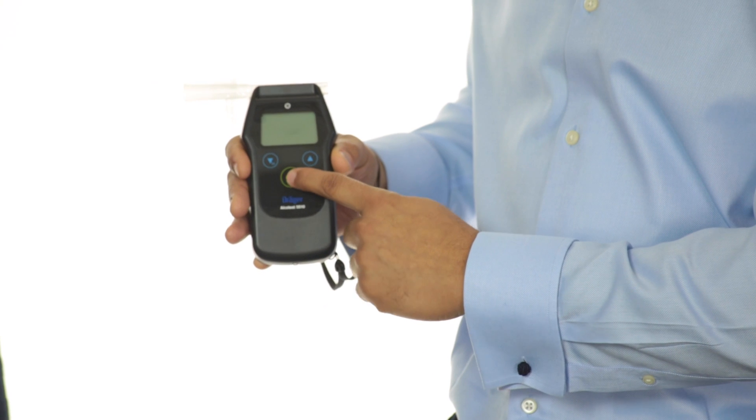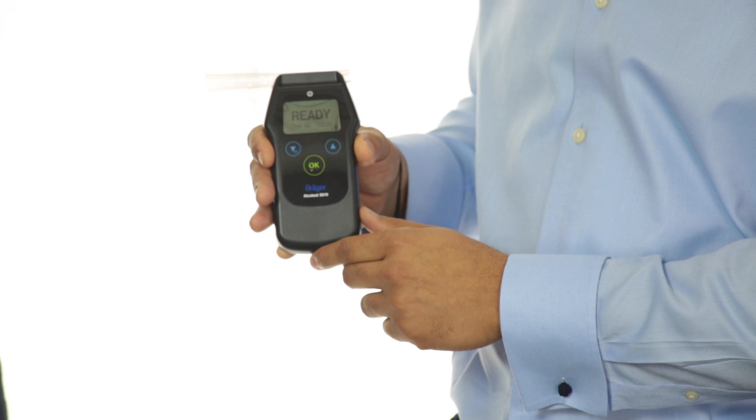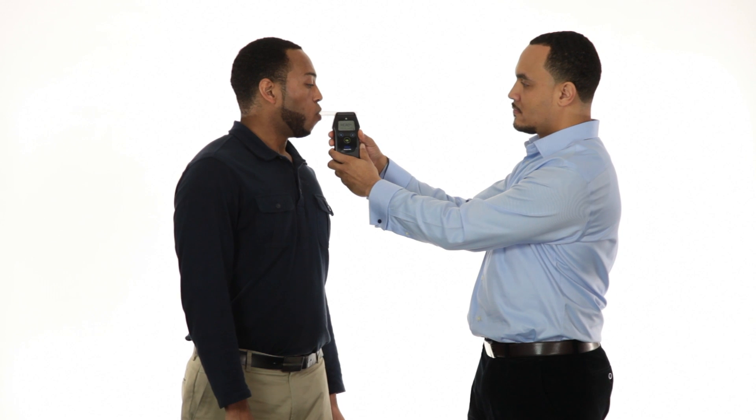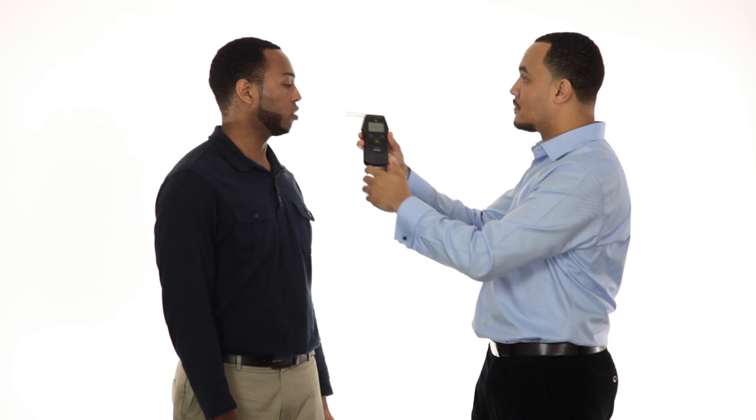To turn on the device, press and hold down the OK button for one second until the start window appears on the display screen. A short beep will sound and the display screen will indicate 'ready' along with a new sequential test number. The LED light will flash green and the device is ready. When the subject is ready to provide a sample, tell them to take a deep breath, place their lips around the mouthpiece, and blow into the mouthpiece without interruption. As the subject blows, the device will make a continuous sound; the LED light will remain a steady green and the display screen will indicate 'blow.' If a sufficient breath sample is provided, the green light and sound will stop, followed by a click as the fuel cell draws in the breath sample for analysis. At this point, tell the subject to stop blowing.